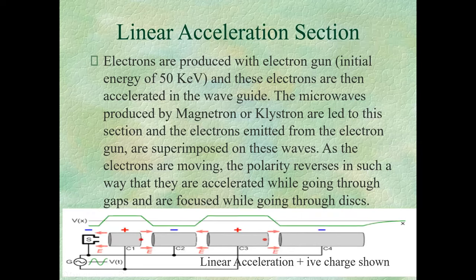Is the ion chamber used as a timer, behind the monitor of the dose? It does not act as a timer, but as we discussed, it is looking at the symmetry of the beam. If it feels like the beam is more on one side and less on the other side, it does give an interlock and it can terminate the radiation. So it is looking at the dose rate and all those things, and it terminates if the beam is out of tolerance. Okay, thank you.